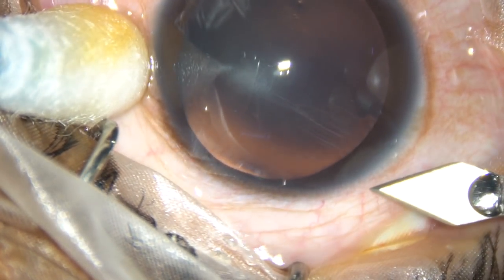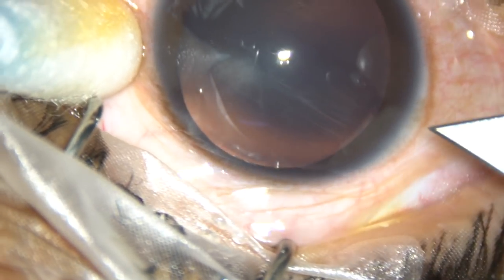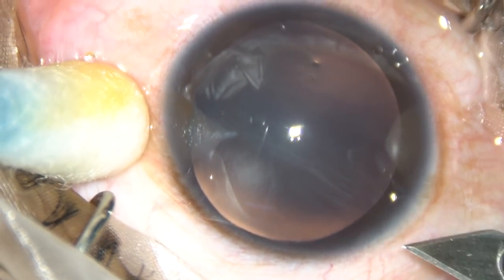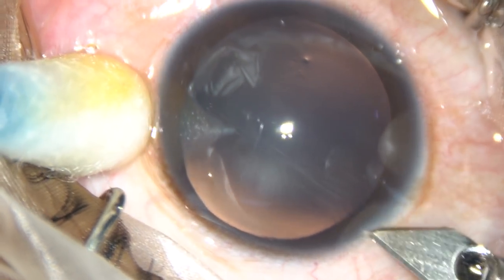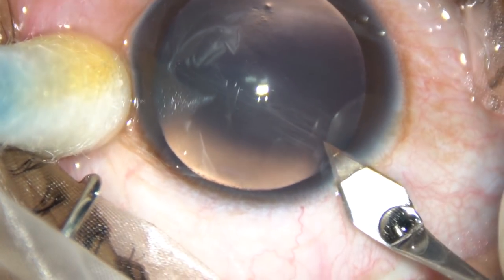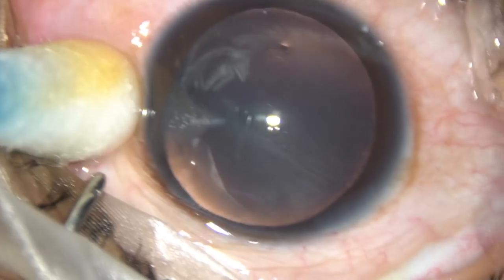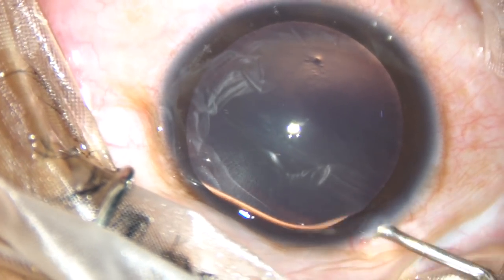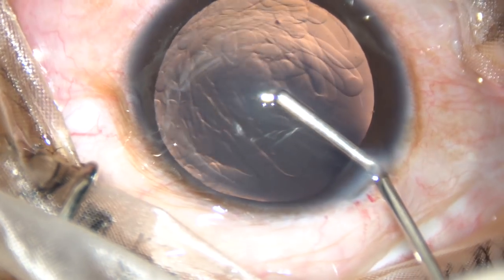Friends, this is Clear Lens FACO. The patient is highly myopic and LASIK is contraindicated in this case. Clear Lens FACO is my first option and phakic IOL is the second option. Let us see how we can do this.